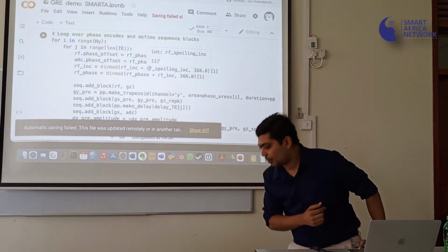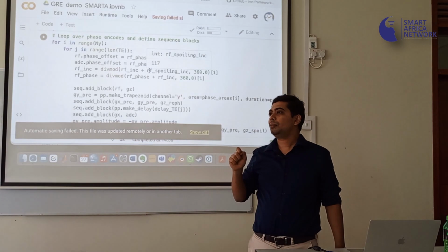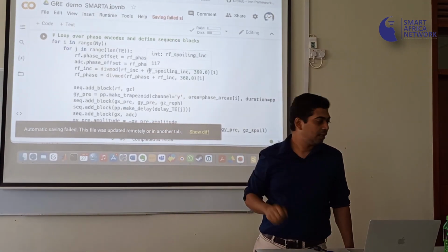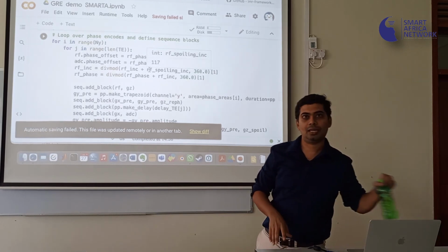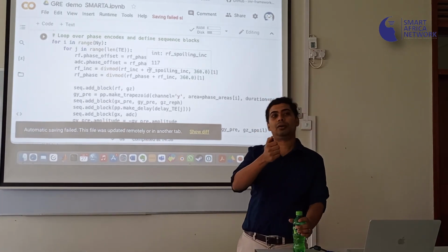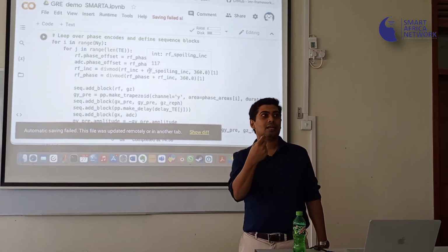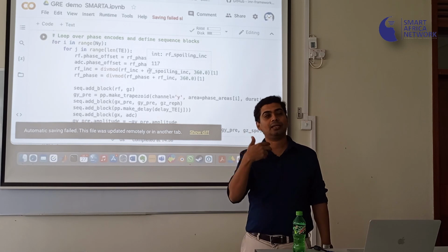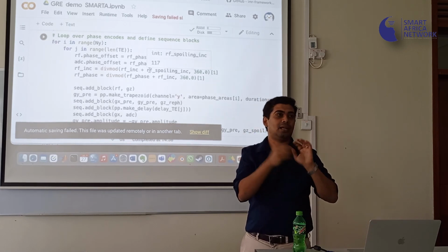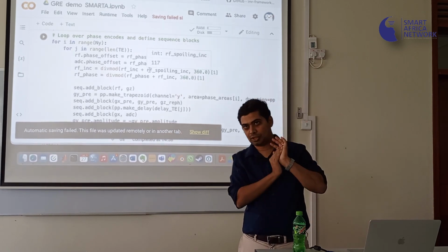In K-space, have they been introduced to the term K-space? Or maybe I can just quickly introduce them to that. Okay. What you have to do in an MR scanner is, in a camera of a cell phone, when you click, you're getting the photons coming from the object falling on a CCD sensor. The number of photons tells you how bright or dark the image is.